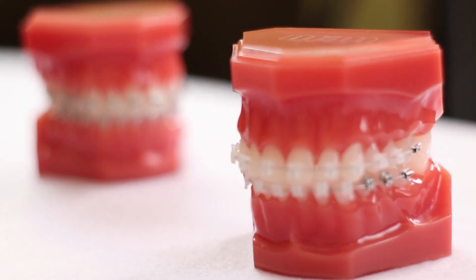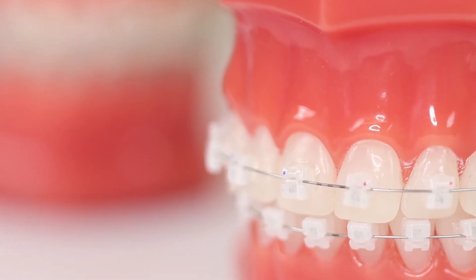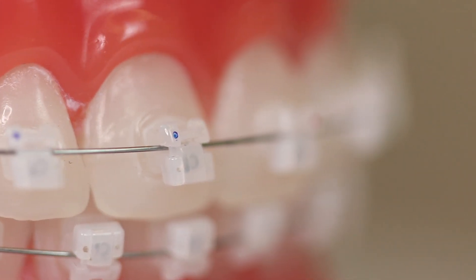Not only does the Genius System have these metal brackets, they also have the crystal or clear type of brackets. Personally, I usually like the metal ones just because I'm very used to them. But if your patient requests it, at least you have the clear options as well.